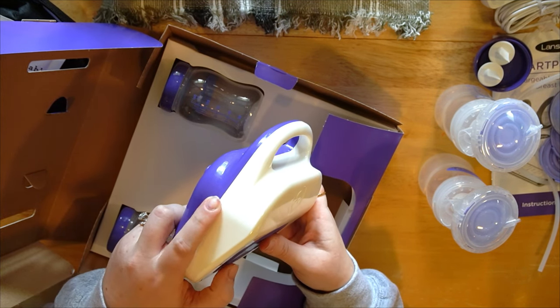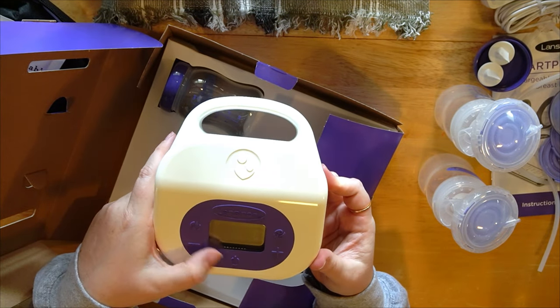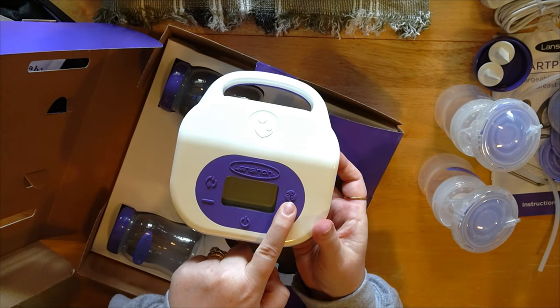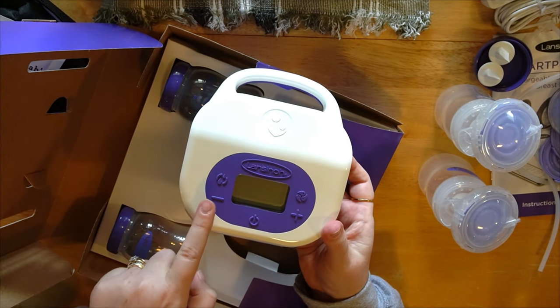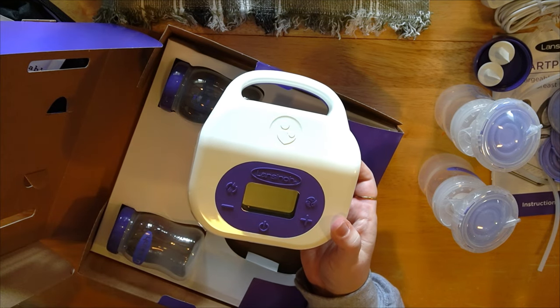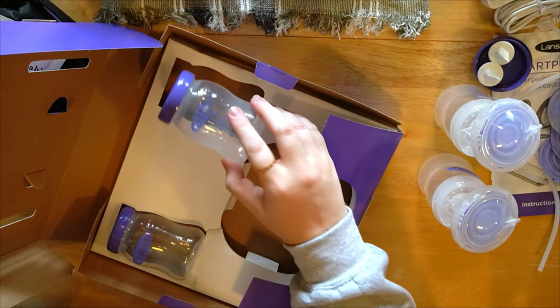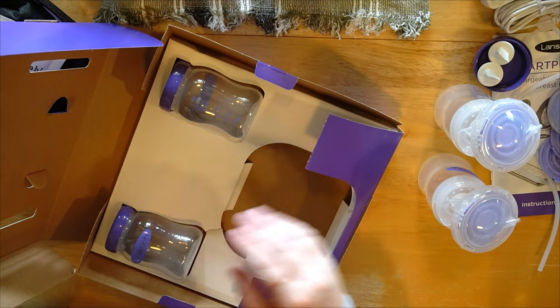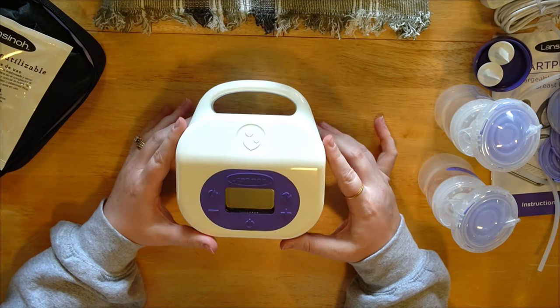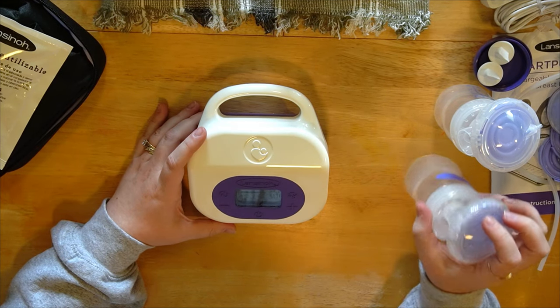We've got the power port over here, the tubing port right there — traditional Lansinoh with the rubber there to give a nice seal with the tubing. The buttons all look the same: power, decrease, increase, frequency, and switching between stimulation and expression mode. They kept it relatively the same. We've also got two additional storage bottles, but that looks to be everything in this container.